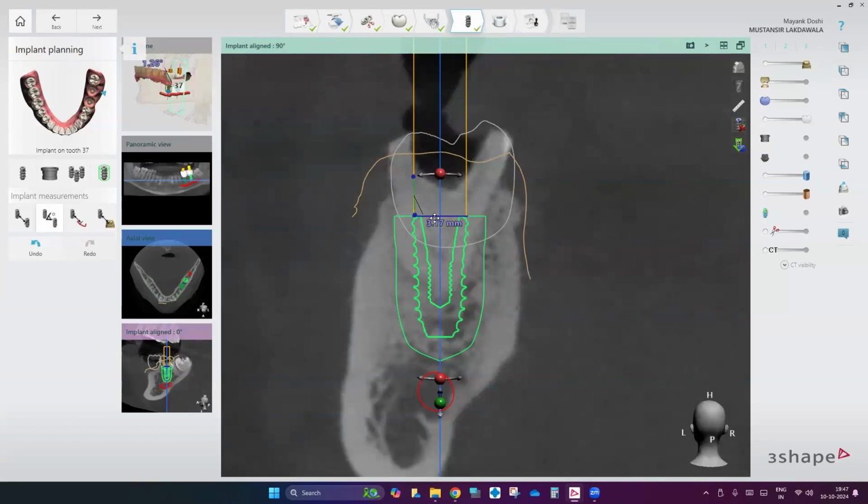Whenever it's an immediate extraction, this is my personal preference: I would rather go ahead with a 4.5 millimeter implant when I'm going to splint it with the neighboring implant, and place it fully guided with almost 40 or 50 Newton centimeter torque, rather than place a 5 millimeter diameter implant freehand and have that question mark in my mind whether I will have the necessary stability or not.